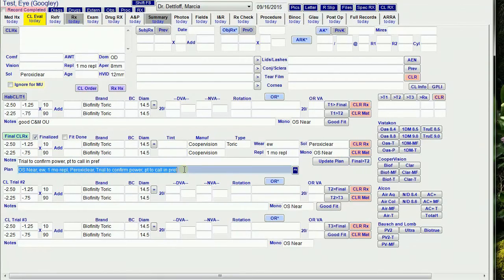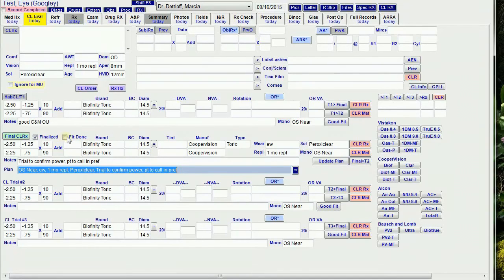Since we have to finalize the RX to have it available for trials, I can check the Fit Done box on the Contact Lens Fit so that I know this is the final RX.